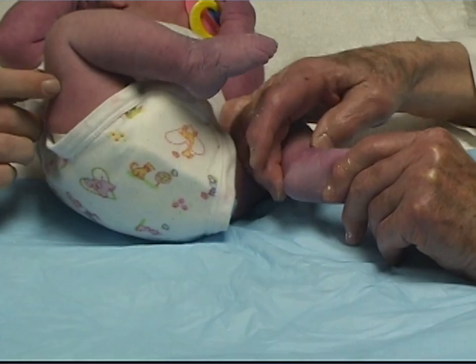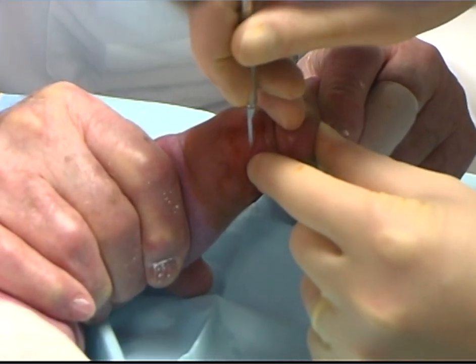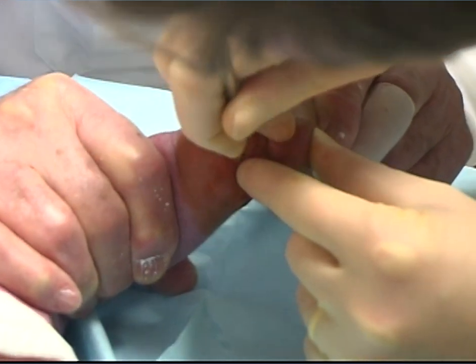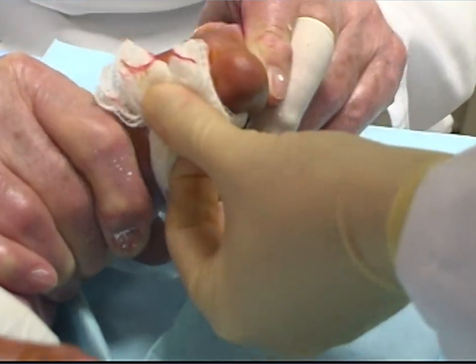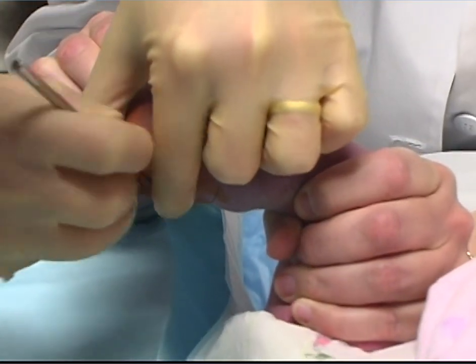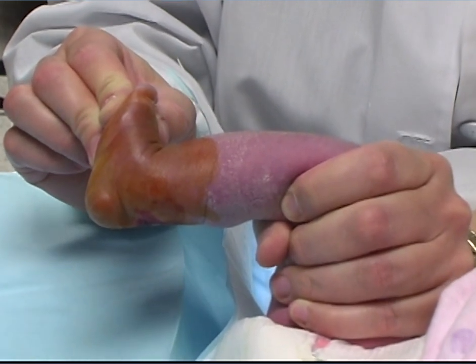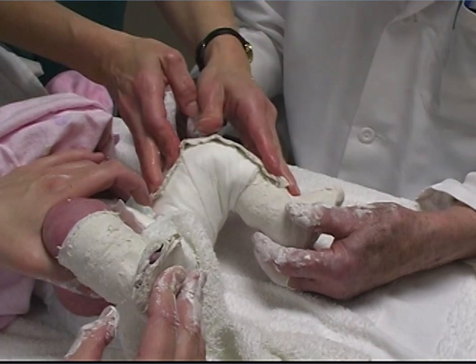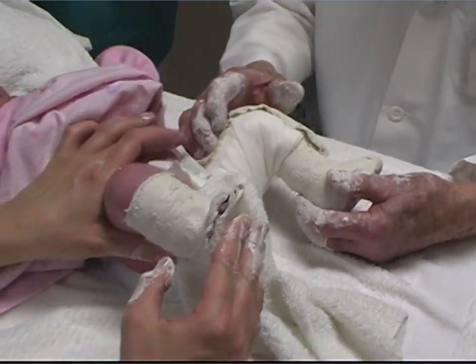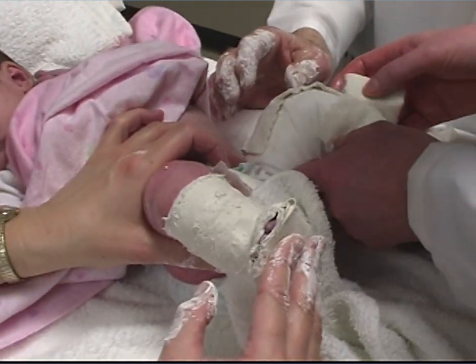Under local anesthesia, the tendon was sectioned on both feet. The feet could now be dorsiflexed 20 degrees. New plaster casts were applied with the feet in 15 degrees of dorsiflexion, the cavus corrected, and the knees in 90 degrees of flexion.